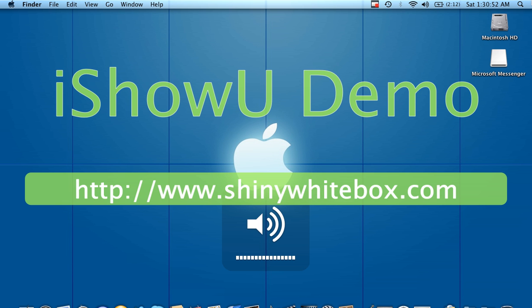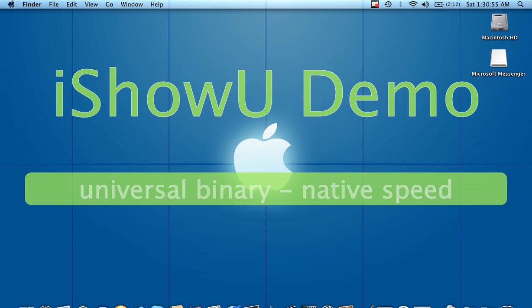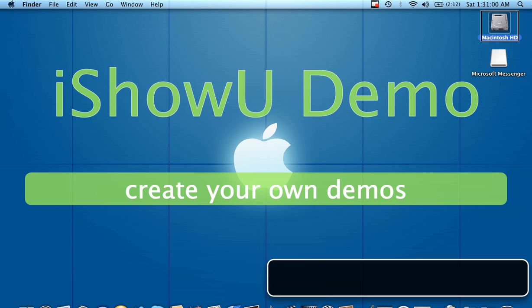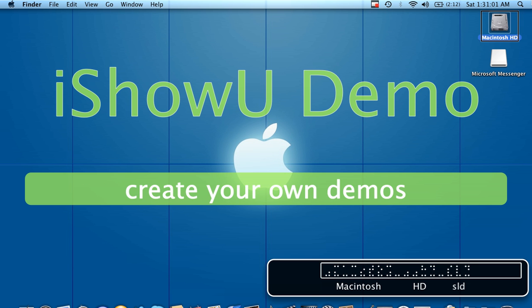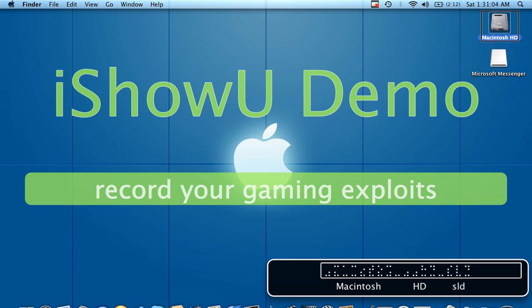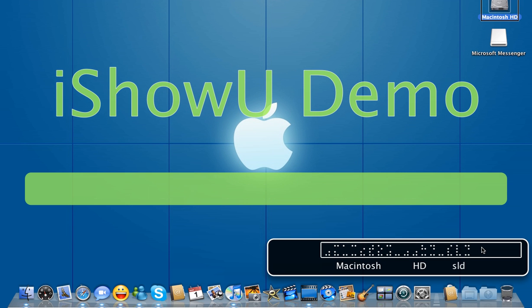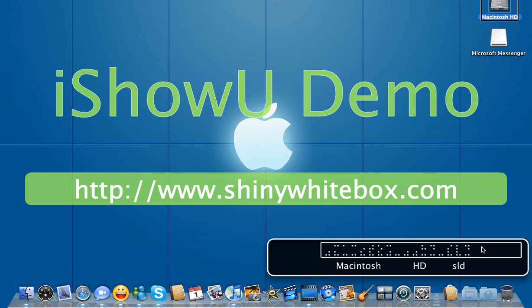Before I start it, I'm going to turn up the volume so that you can hear it. Okay, so again Function Command F5. VoiceOver on. Finder, Macintosh HD selected.